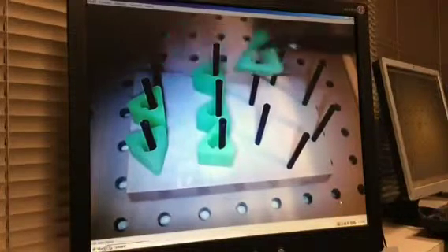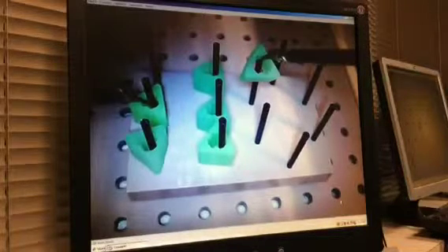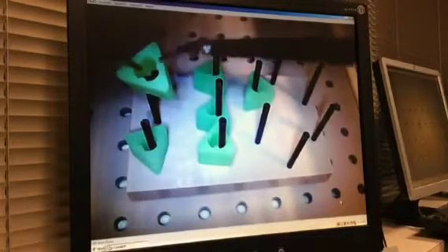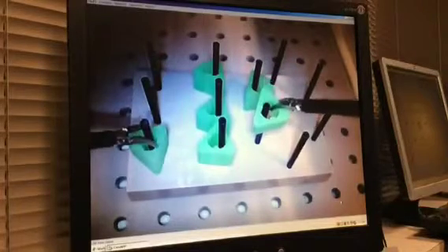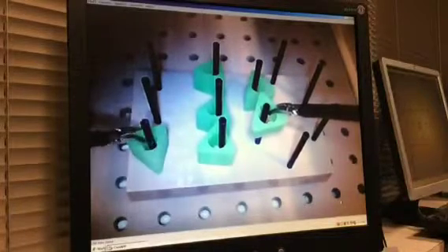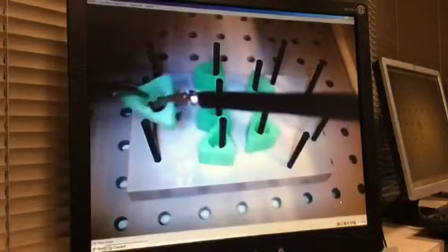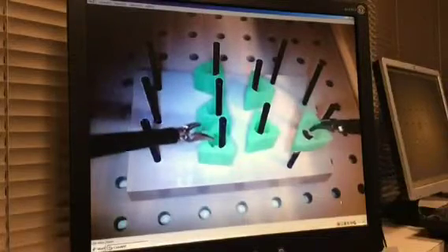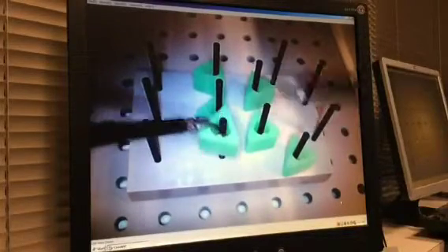First of all, the peg transfer starts with all of the pegs on the left sided configuration, which is two straight lines, and the goal is to transfer them all over to the right circle configuration and back again.